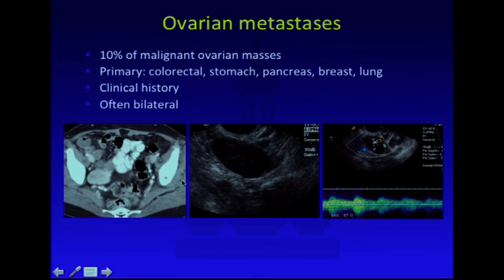But this is a patient who presented, actually, she had a CT scan, I think, for abdominal pain, and we saw this brightly enhancing mass in the right adnexa. So an ultrasound was performed, and this is the right ovary here, and you can see on color Doppler, although the ovary is not very much enlarged, there is this disorganized flow with low resistance flow in this patient, and she had a Krukenberg tumor to the right ovary from a GI primary that hadn't been detected so far.